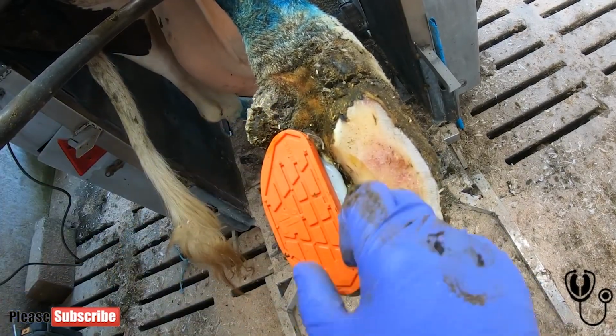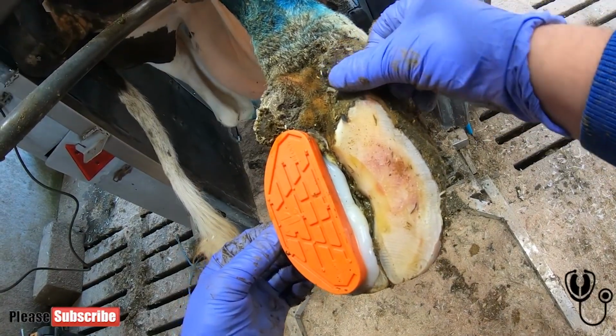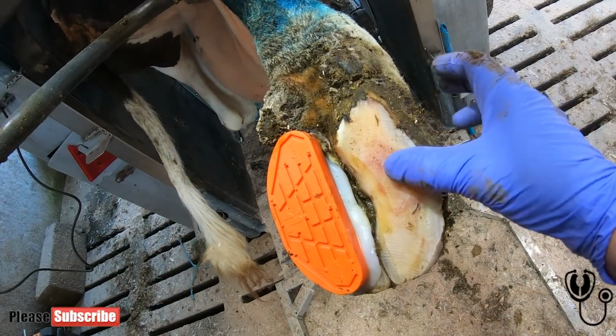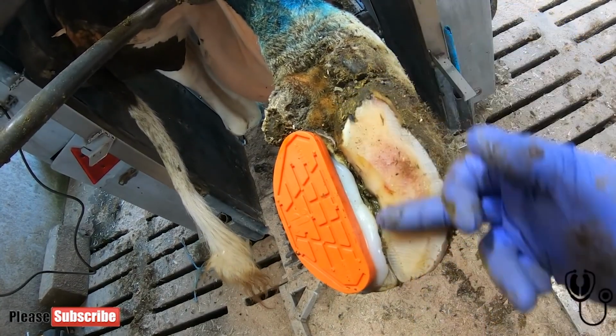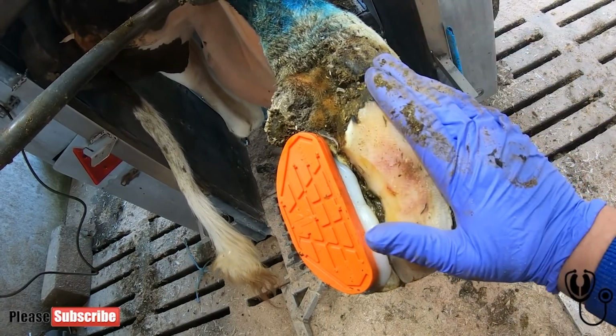Now, that is actually hard already, so we can let it down. I didn't think this was going to have healed in one go, but it appears it has. It is still soft here, so you can see the sponginess as I push down, but it is good sound horn, so we're not going to touch this anymore. We want to leave it as intact as possible, but we don't want it to be insulted further.